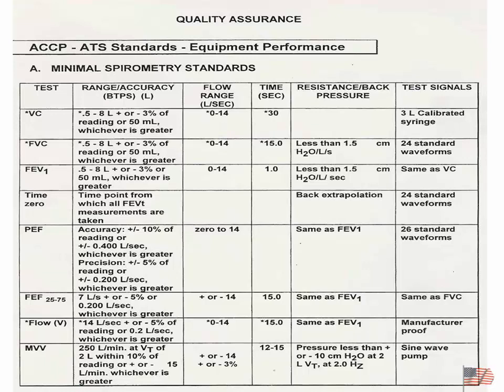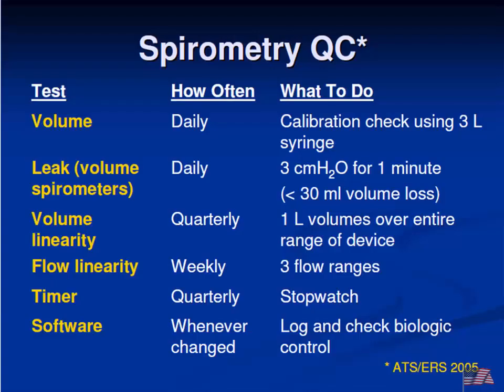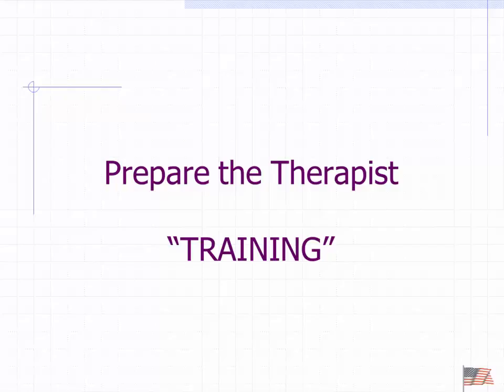Not a chance in the world that you would need to memorize this. But for each test that we do, there's a range of accuracy that we have. Can we just leave it at that? Yeah. Good. For our purposes, we're just going to go with daily, because if we do it all daily, then you're doing it wonderfully. But there's various things, everything from the software, whenever it's updated, to make sure that it's functioning appropriately.